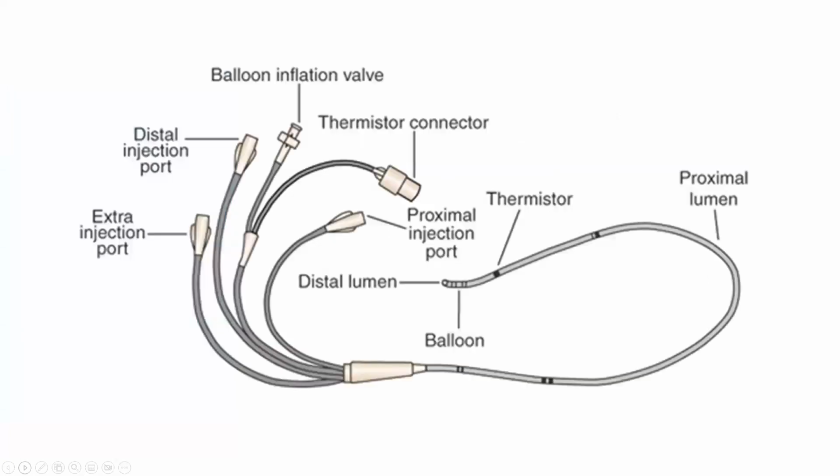A little bit on the actual anatomy and physiology of a Swan-Ganz catheter. Notice this one has 4 lumens, not 3, 2, or 1. You want to familiarize yourself with the actual lumens, the ports, what the ports are used for, and those sorts of things. Of course, I've already talked about it, but I'll talk more about it as well. But it's important that you spend the time reviewing the stuff if you're hazy on it and prep for the exam.